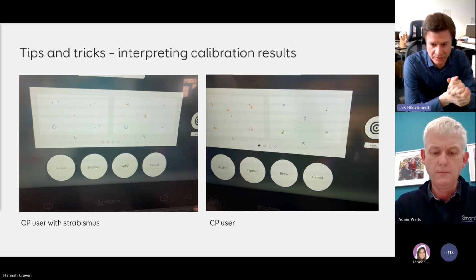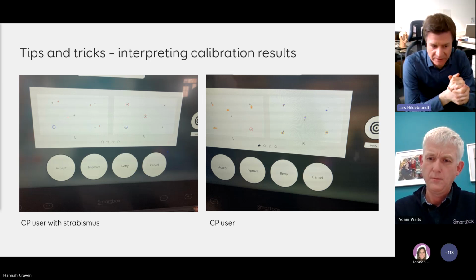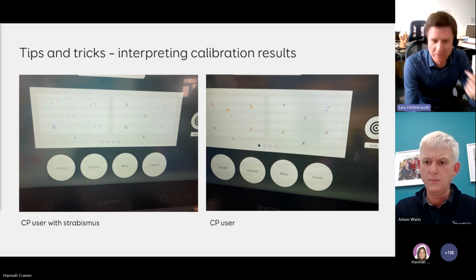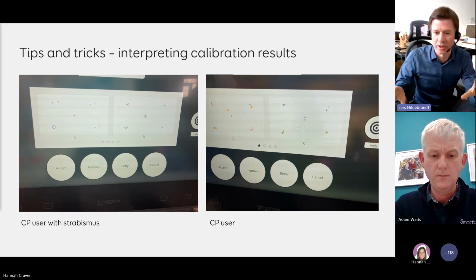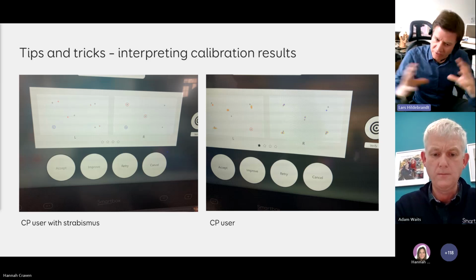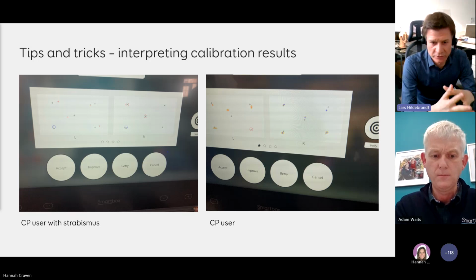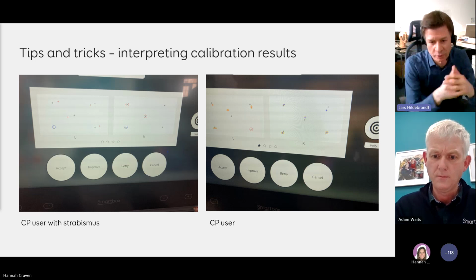As said, this is not available in Grid, and therefore, for those users where you have the expectation that things might go wrong, you want to start with IntelliGaze first and understand what is the best setting for the user. Once you found good settings, for example, I always calibrate the right eye and always with 1 point, or always pull the points in the center of the screen, then you can use these settings in Grid as well and try a calibration there. But you don't get these detailed results in Grid. That's why you want to start with IntelliGaze first.